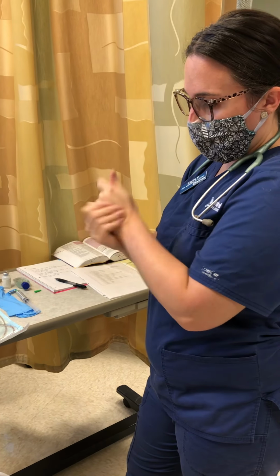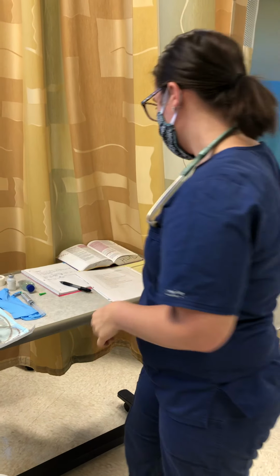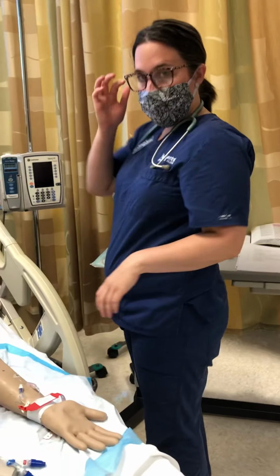And I'm here to give you your packed red blood cells. Okay. Gonna verify your name. And you can go ahead and pause.